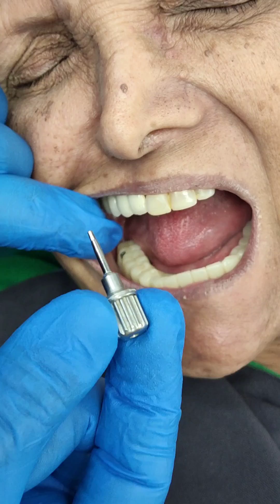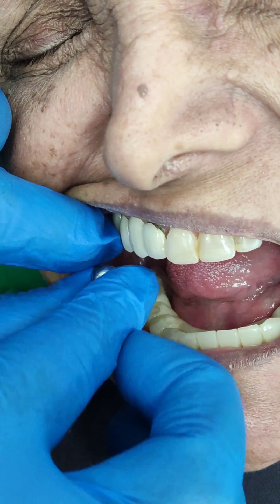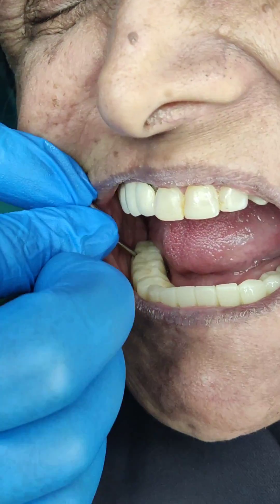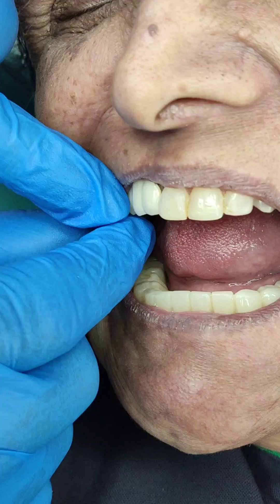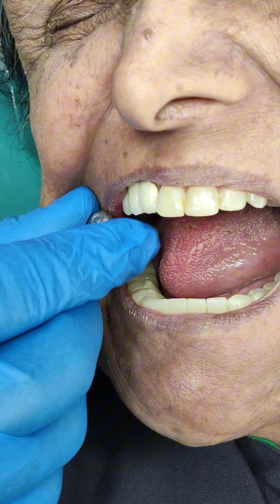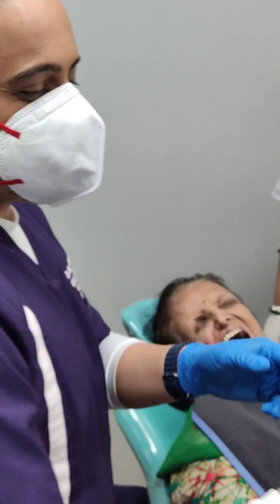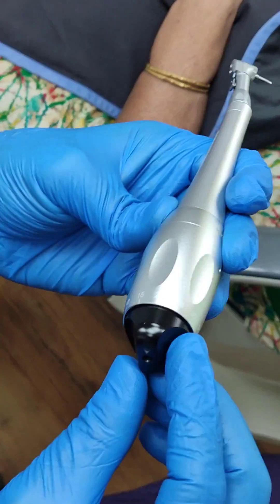I have the smallest hex available to me. I'm placing this and trying to orient it because this is a tilted implant — it's almost impossible for me to engage that hex, despite the fact that my patient is trying to open her mouth as wide as possible. I'm still not able to engage the angle of the hex, and that is where the torque wrench comes into the picture.